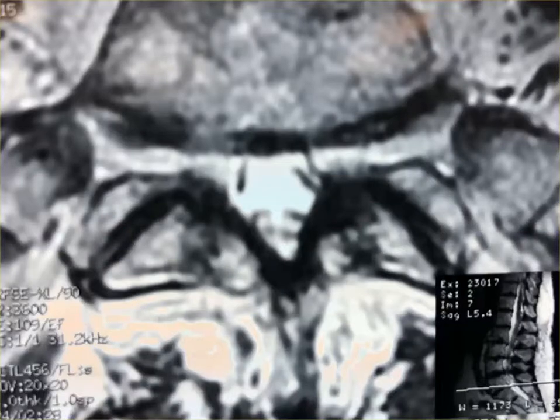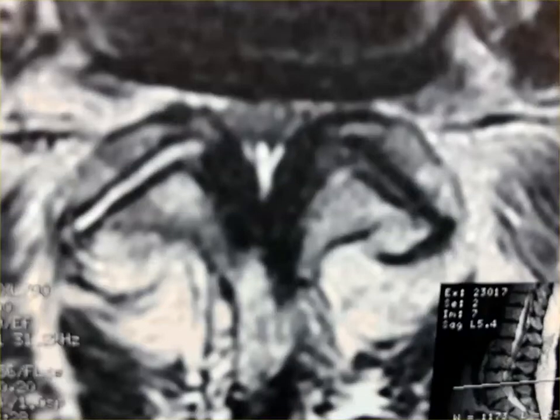So here's an axial cut, and the spinal canal where the nerves are is nice and round, and you can see the little nerves themselves. They're like pieces of spaghetti. This is at L5-S1. This is a normal spinal canal. This is the next level up, L4-5, and you see how there's no room for the nerve roots. It's just a very small thecal sac, and you don't even see any CSF. And that triangle in the back is fat. There's a little bit of fat there, and you're going to see that fat intraoperatively.